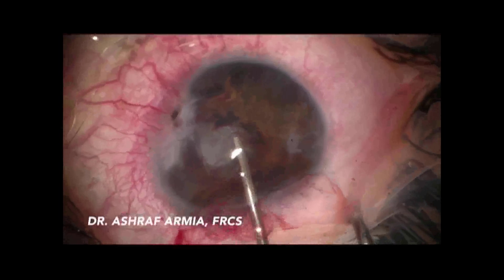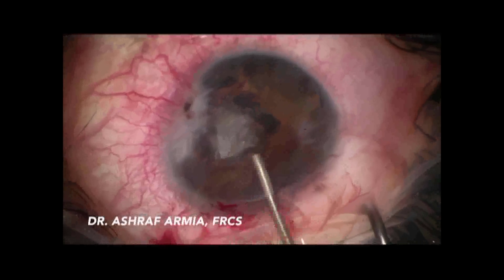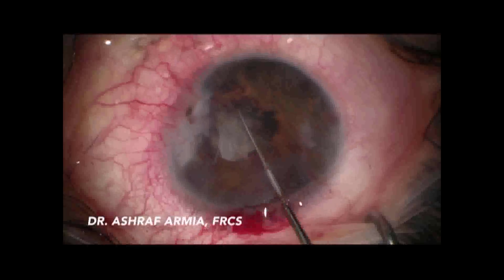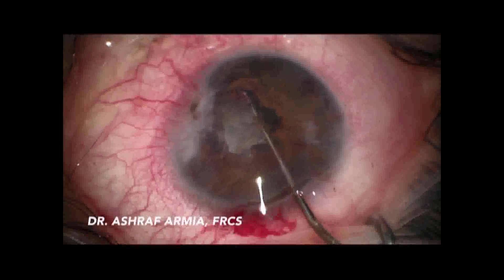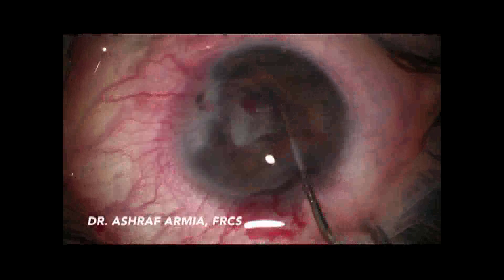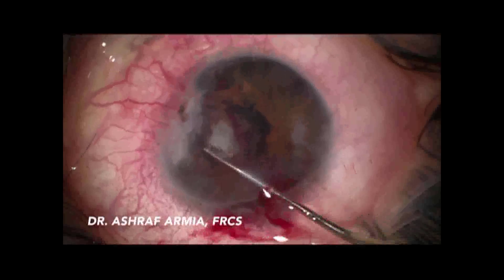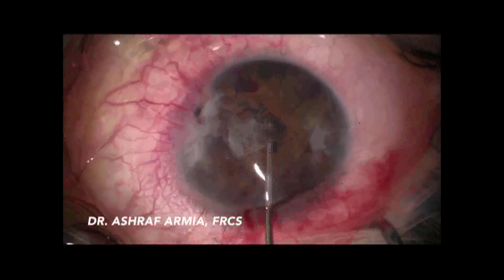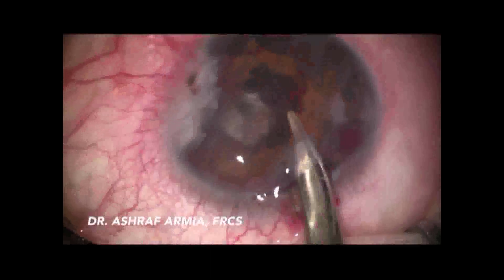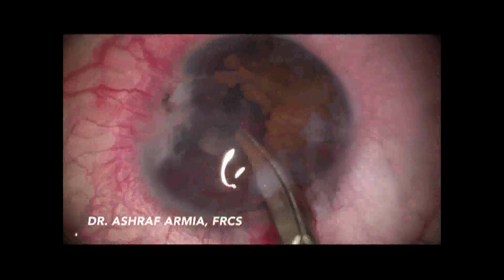I was surprised by what was behind the foreign body. I faced friable iris tissue with a fibrous lens. I injected more viscoelastic, trying to find a safe way to complete the case. I closed the wound to a 2.0 mm incision to maintain the pressure inside the eye and handle the anterior chamber.